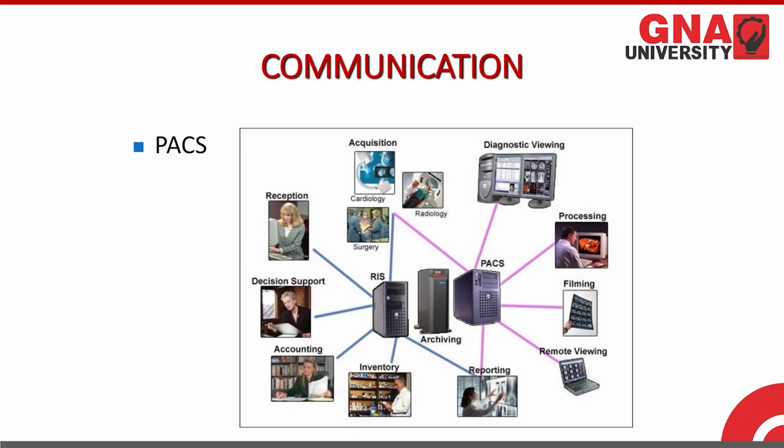So the images are acquired in the CT room. From the CT room, for reporting, they are digitally sent to the radiologist room with the help of PACS. In the radiologist room, the radiologist creates a diagnosis from these images, and from that, the radiologist digitally sends those images to the referring physician. This is the workflow of PACS.